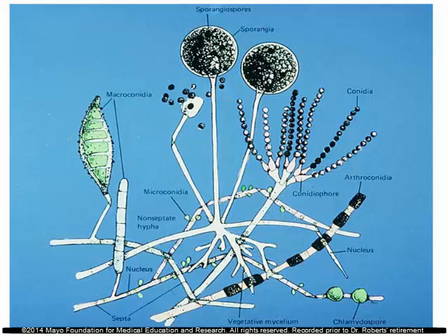You can notice in the center there's a tall stalk with a round sac at the top, and this is a sporangium with the zygomycetes. Then we go from there down to penicillium, which is like about 2 o'clock, which has different type of sporulation, and you can just look around in there and see that many of these fungi sporulate differently, and so we will begin to look at some of these as we go along.